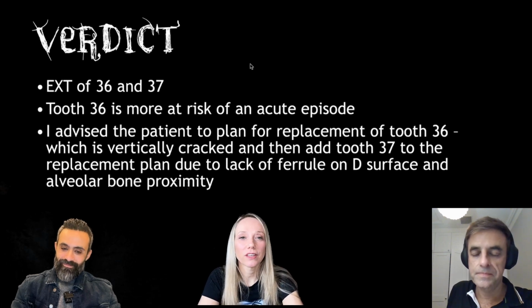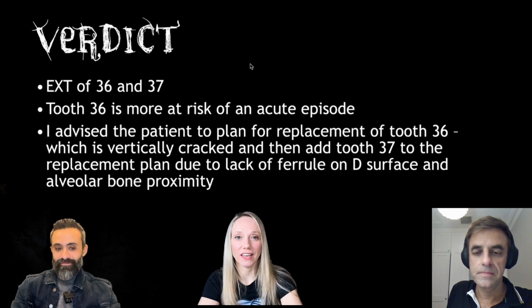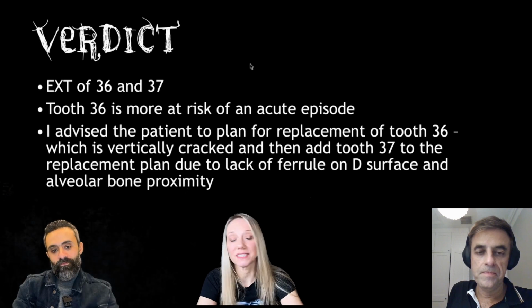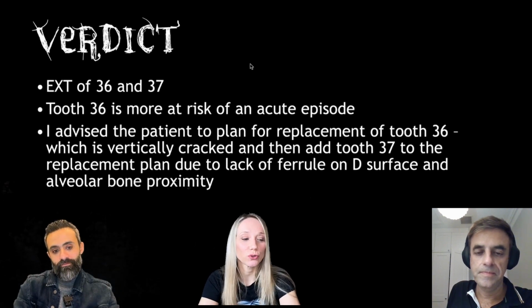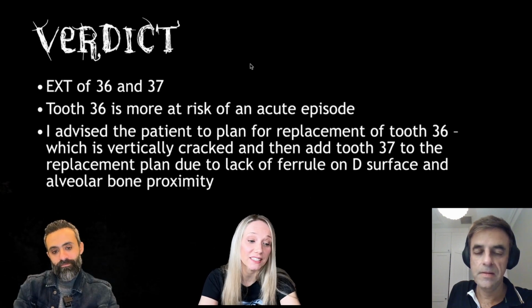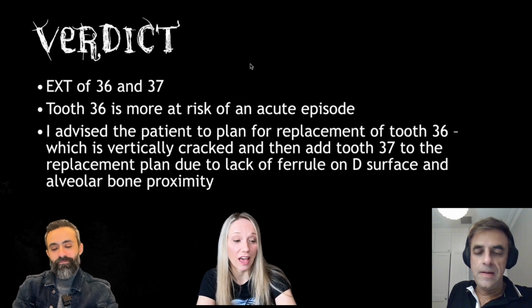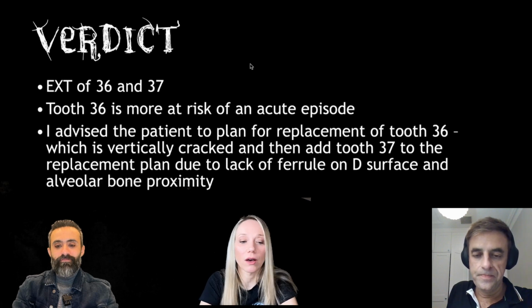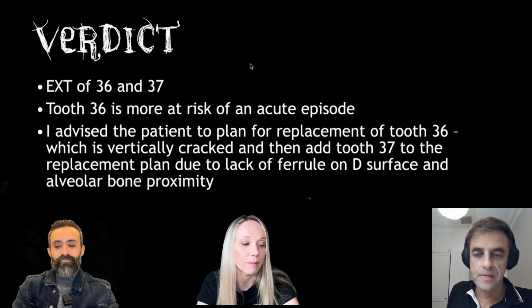And do you think there are some instances when the patient comes with a very old treatment that recently became symptomatic? How can we use the CBCT to assess if we actually have to treat the tooth to give a benefit to the patient, or we should think about maybe extraction and putting an implant?